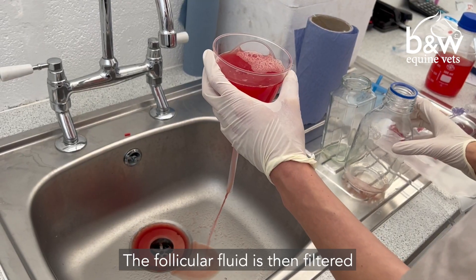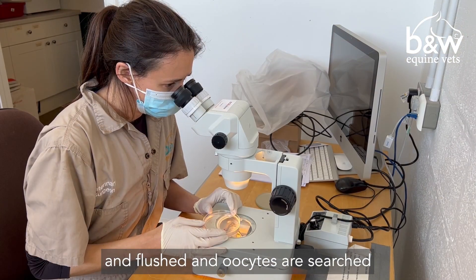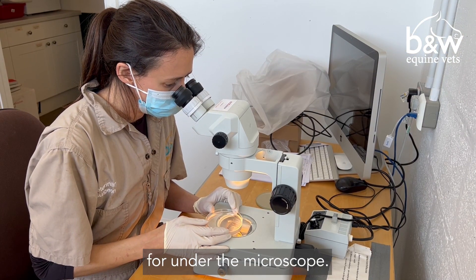The follicular fluid is then filtered and flushed and oocytes are searched for under the microscope.